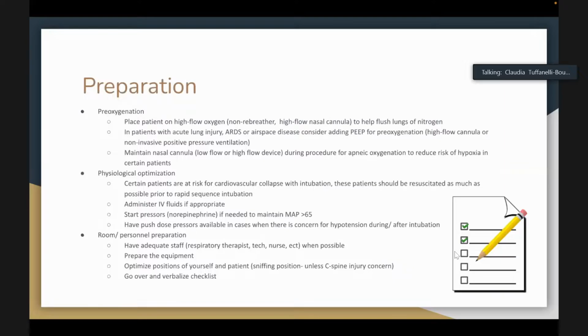In this lecture, I provided a sample checklist, or you can make one for yourself. Eventually you may not need it, but when you're learning and you're doing your first 100, you have that checklist to go through and make sure that you're checking everything off and doing everything beforehand, so that when you give the patients the medications to sedate them or paralyze them, you have everything you need. And being well prepared is what's gonna lead to success.